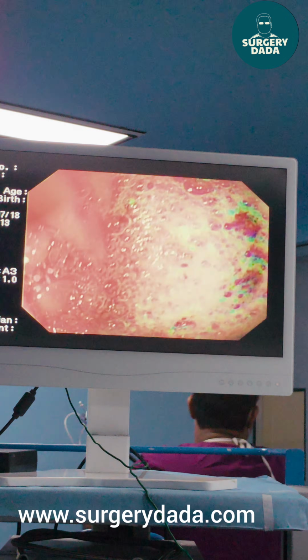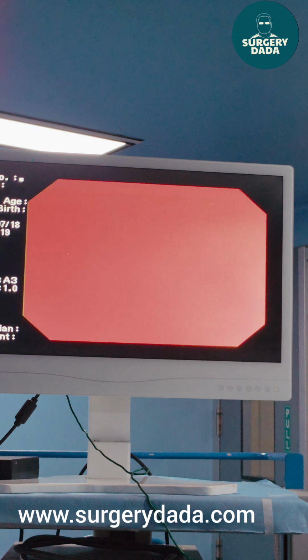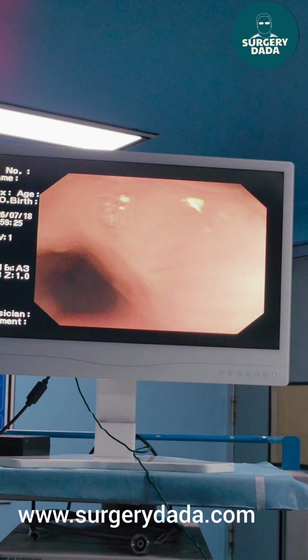So I'll do a retroflexion. Okay, everything is okay. We'll do some suction and we'll get back. So you can see rest everything is okay.